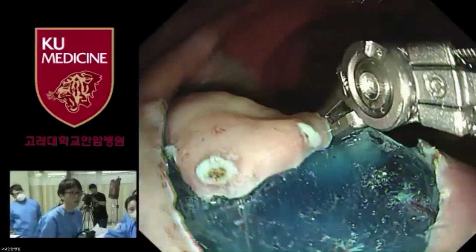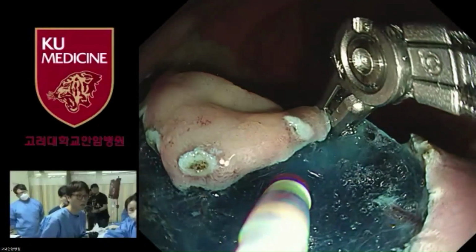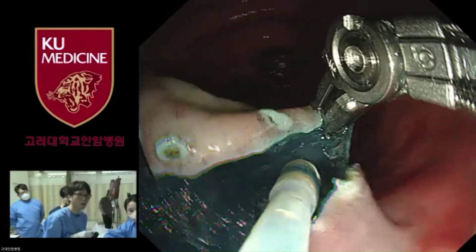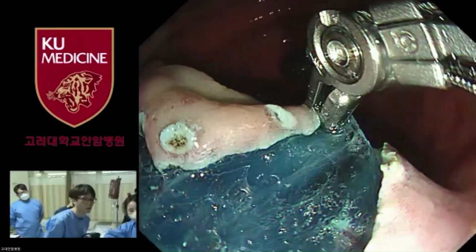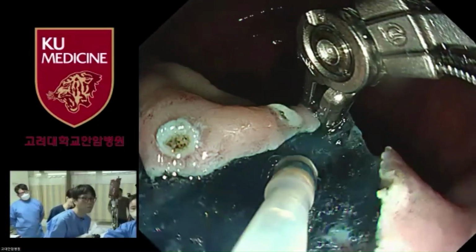During the procedure using the robotic devices, another assisting person is waiting next to the endoscopist, right? Yes. As I showed you, there are two controllers, the button type and lever type, and we can attach the controller on the upper shaft of the endoscope, just under the controller side.